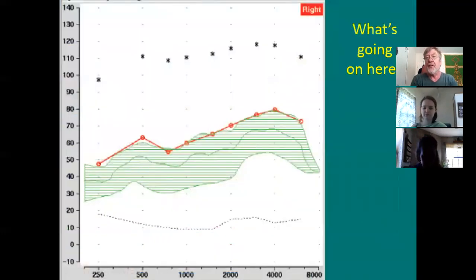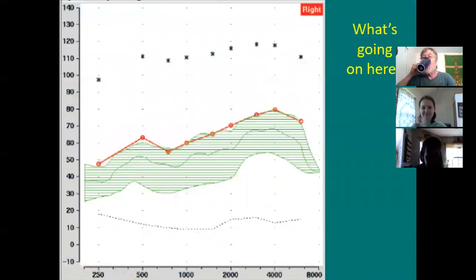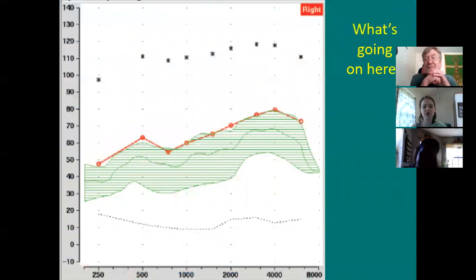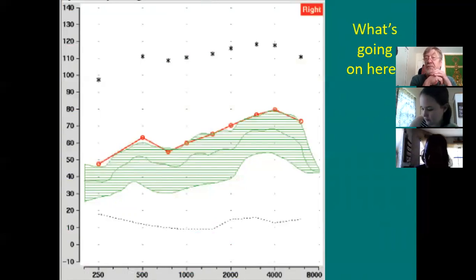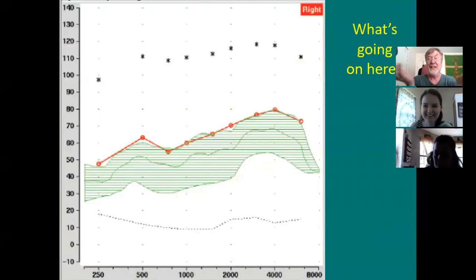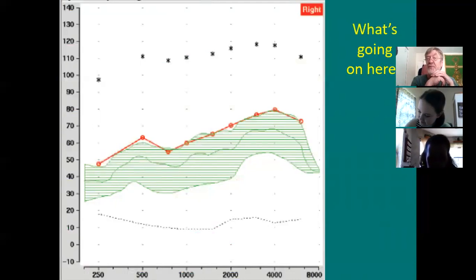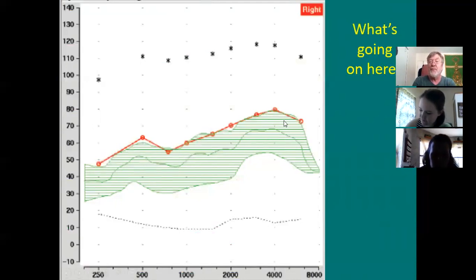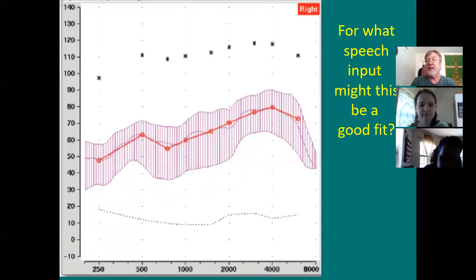What's going on in this picture? There's no target. But what else do you see about the speech and the thresholds? Can't hear anything — because all of the speech is below his hearing thresholds. It's not audible. Every piece of it — the whole green belt here is below his hearing thresholds. It's inaudible.